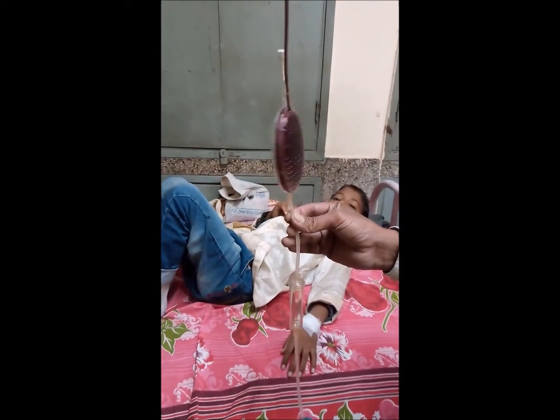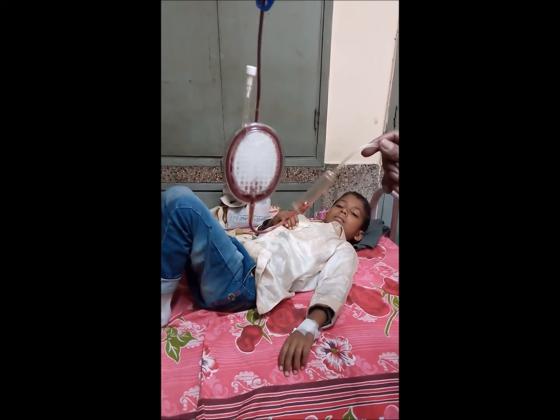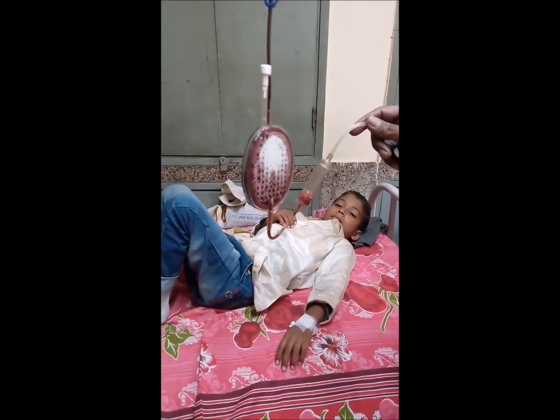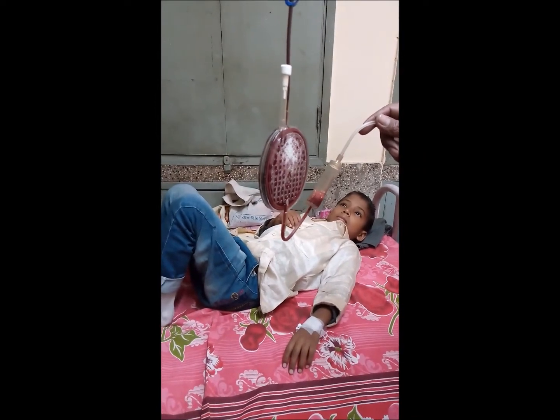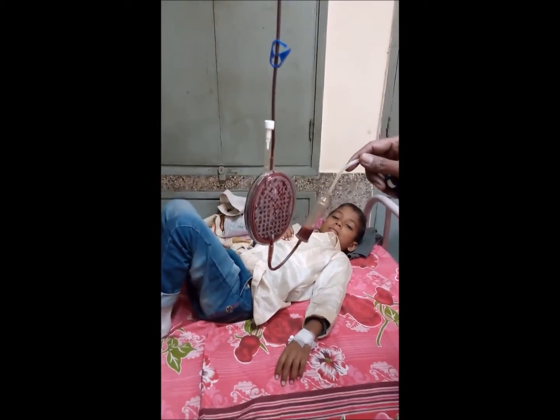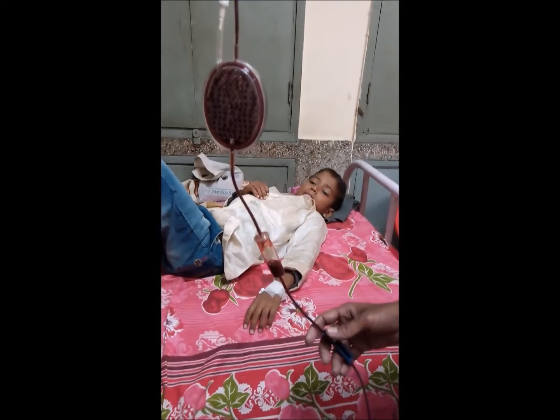With the use of the filter, the duration of transfusion is only slightly increased. With the advent of newer leukocyte reduction filters, their efficacy is as good as pre-storage leukoreduction. At our center, we advise newly diagnosed cases to start using leukoreduction filters from the beginning and use it every time for each transfusion.